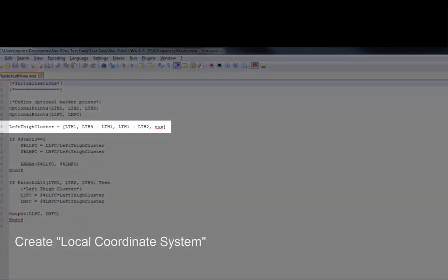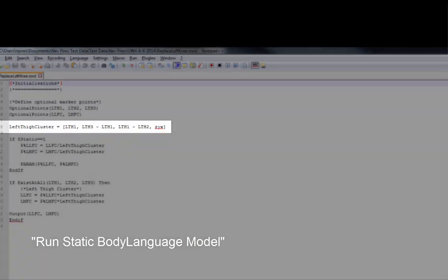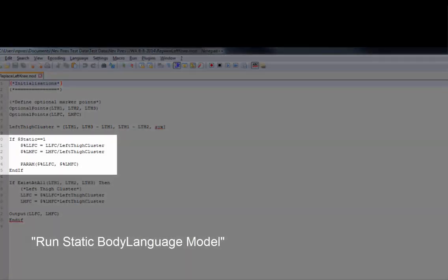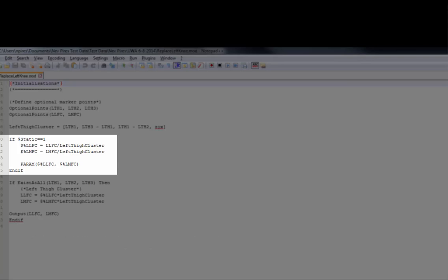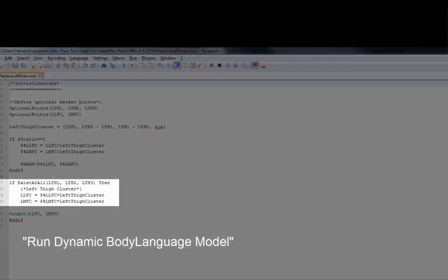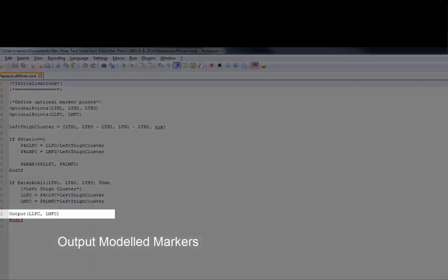Then I'm going to create a local coordinate system for the left thigh cluster. Everything run in this first if-statement is run in the static Body Language model part of the pipeline — we're placing the knee markers in the local coordinate system of the left thigh cluster. In the second if-statement, which is run in the dynamic Body Language model part, we're saying that if the markers of the left thigh cluster exist, we can recreate the knee markers in the global coordinate system, and finally the markers will be exported as modeled markers.